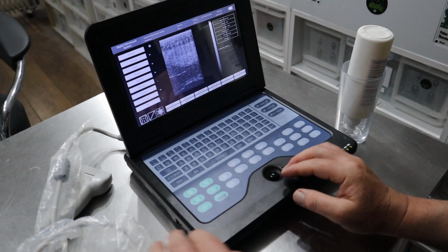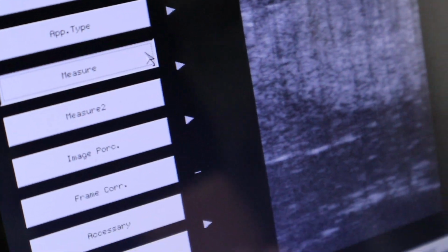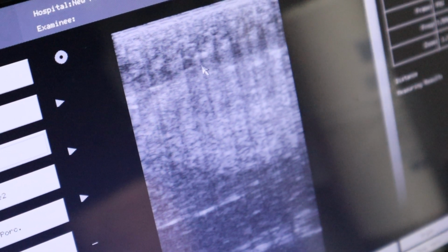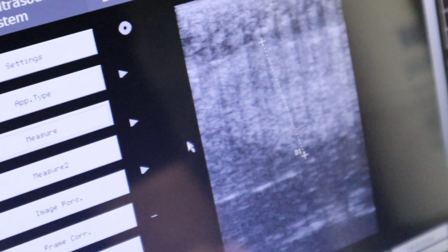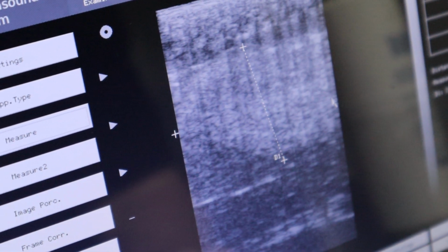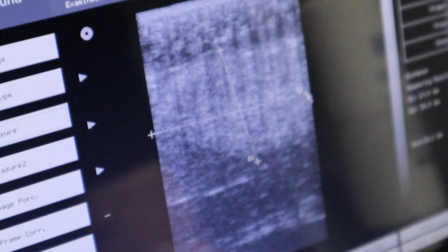So let me just check how I set this up now. It's at the bottom. I think it is measure, is it measure? Yep, at the top. And then distance. So there's the egg, I can see top of the egg there. Bottom of the egg is down here. Curvature goes all the way off the screen really. They are big. You can do a pass on the black if you want. Yeah, I think we'll go to there. So we're looking at an average of 33.6. So she's got some really big follicles, Jared. We need to keep an eye on her. She could go in the next couple of weeks.